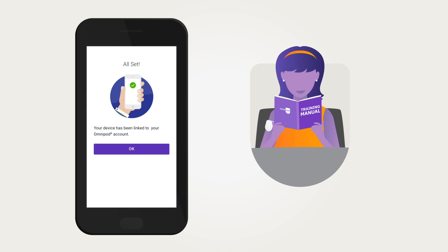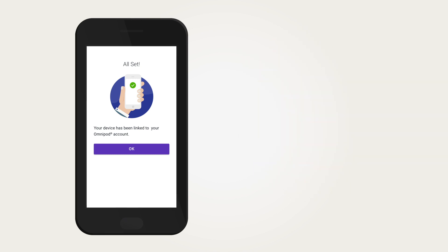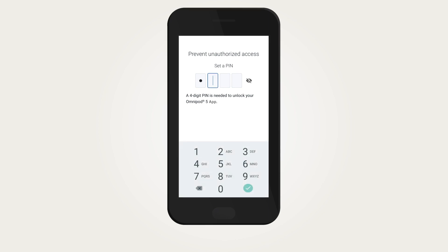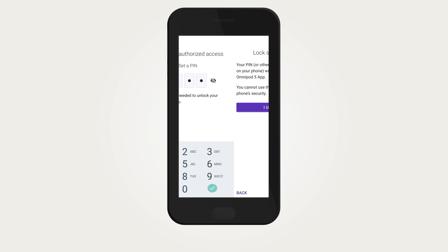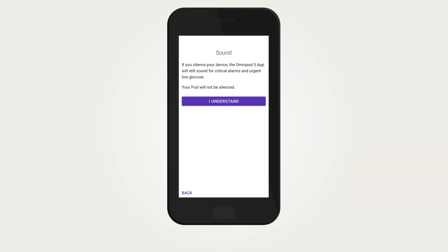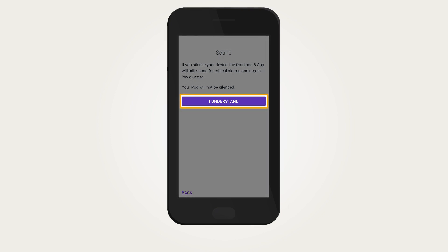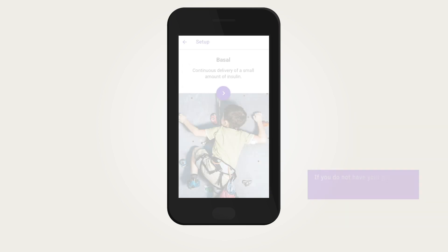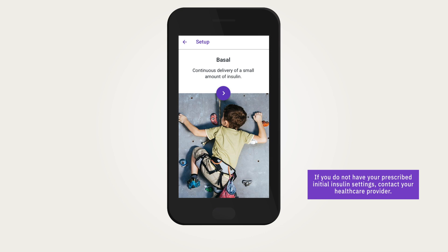Engaging in training before starting the Omnipod 5 system is essential for your safety and success. Before entering your personalized settings, you will be asked to confirm your understanding. If setting up on the provided controller, you will be prompted to enter a screen message, select a background, and create a security PIN. If setting up on your own compatible smartphone, phone security must be turned on, and phone notifications and sound should always be turned on. Your smartphone device's PIN will be the same PIN used in the Omnipod 5 app.